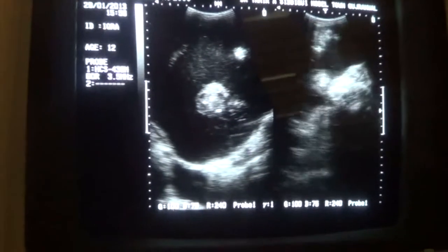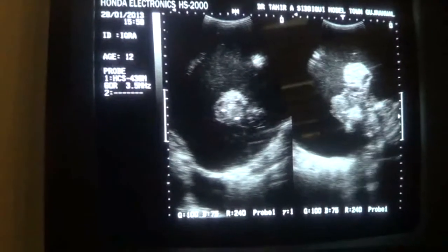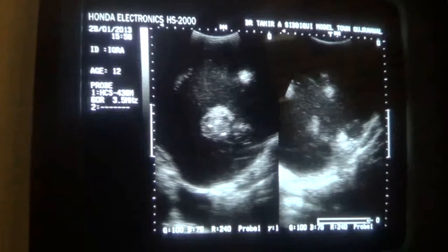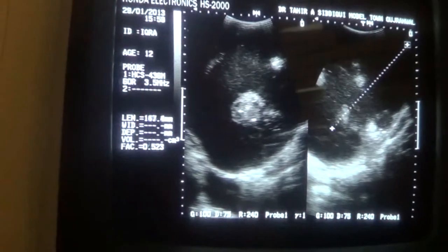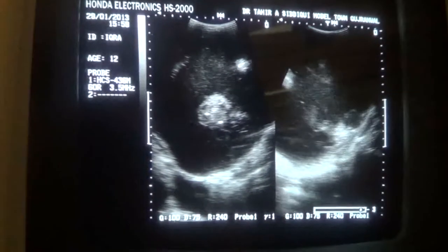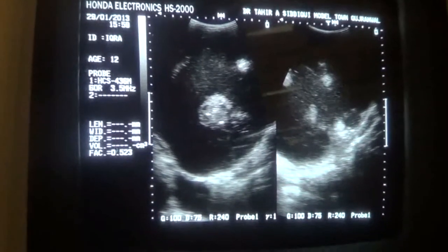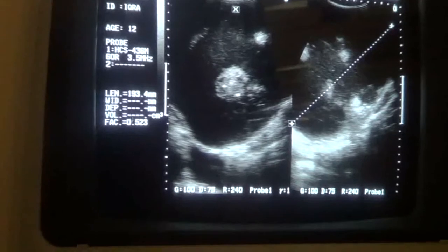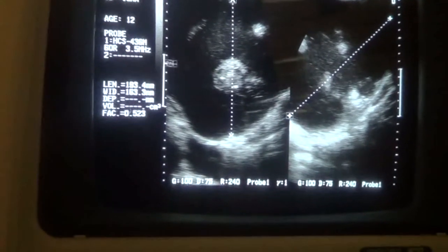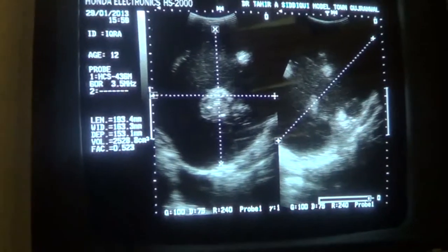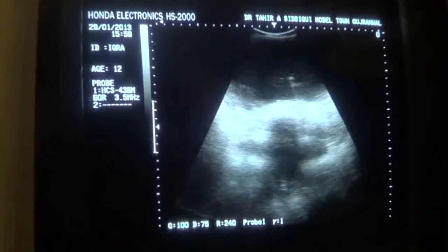Let's see what is the approximate volume of this cystic area. This is the longitudinal section. The calculated volume is more than 2500 cc, and when this particular intervention will be performed, I can assure you the volume will exceed 3000 milliliters.